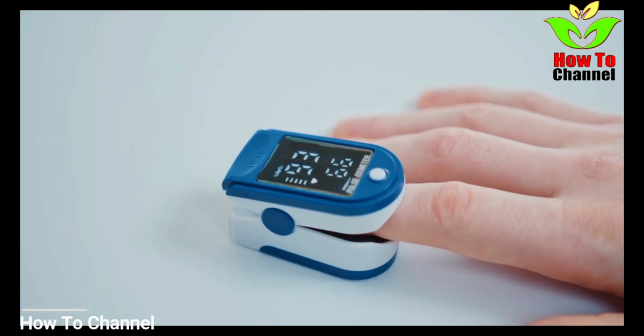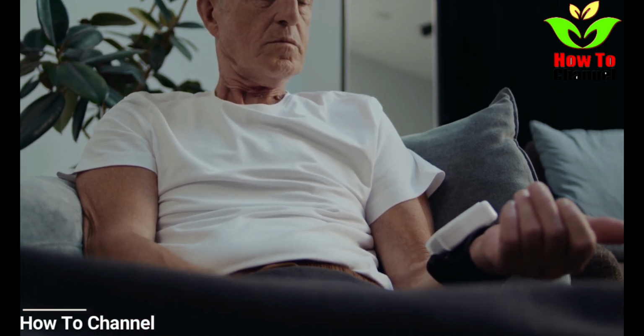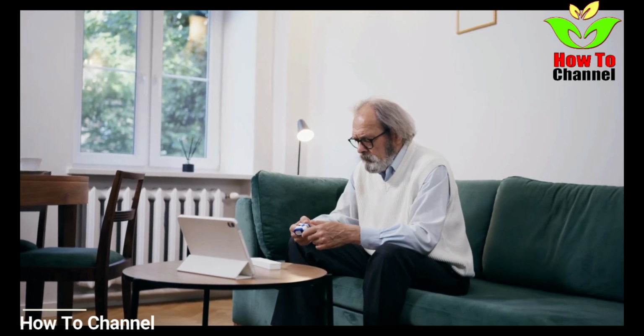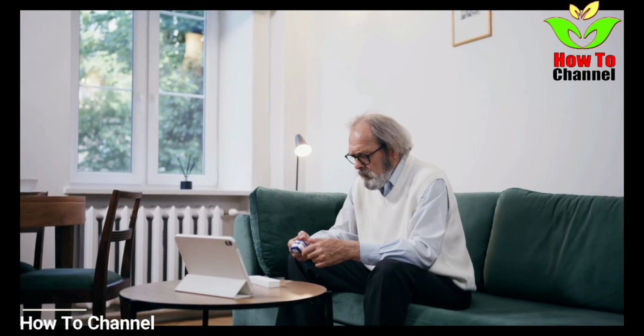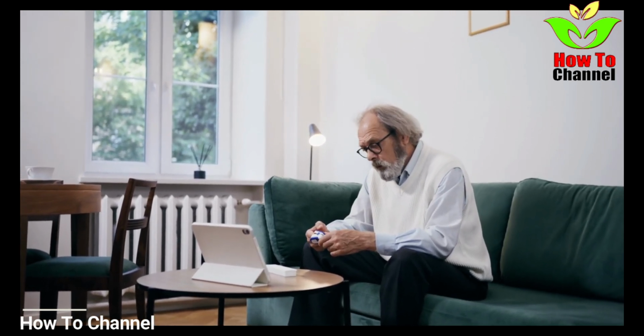But this does present a problem. When we measure oxygen saturation of blood, we want the measure of oxygen saturation of arterial blood, not venous. This is because the arterial blood is still oxygenated, having not delivered the oxygen to the tissues yet, whereas the venous blood has already delivered oxygen to the tissues and is mostly deoxygenated. Because of this, only arterial blood can supply us with a reliable reading of how well we are oxygenating our blood.